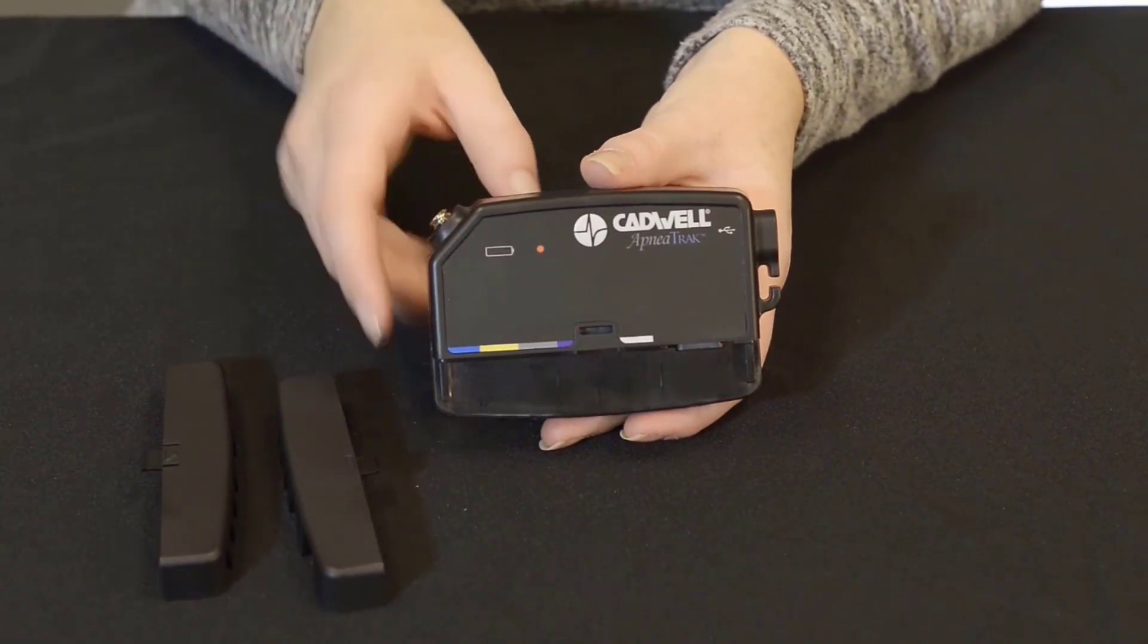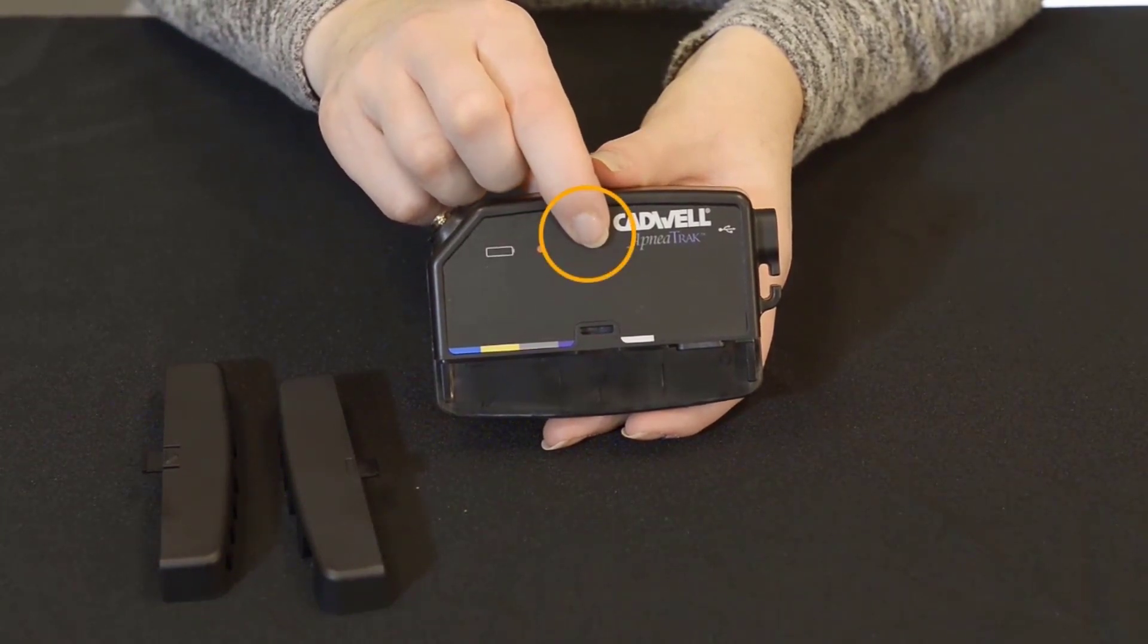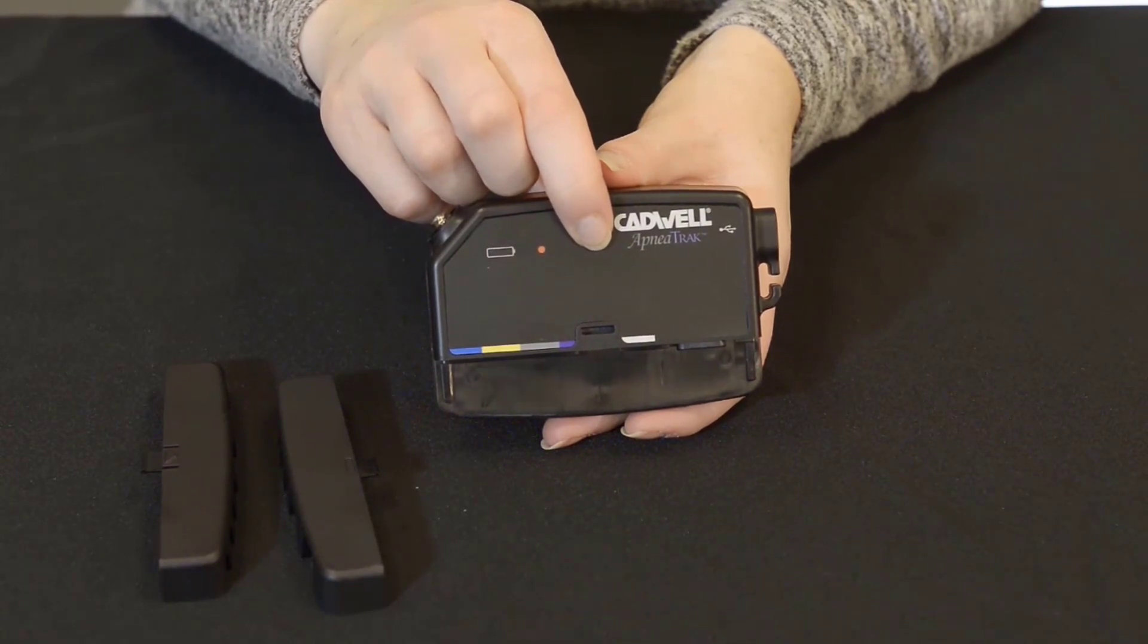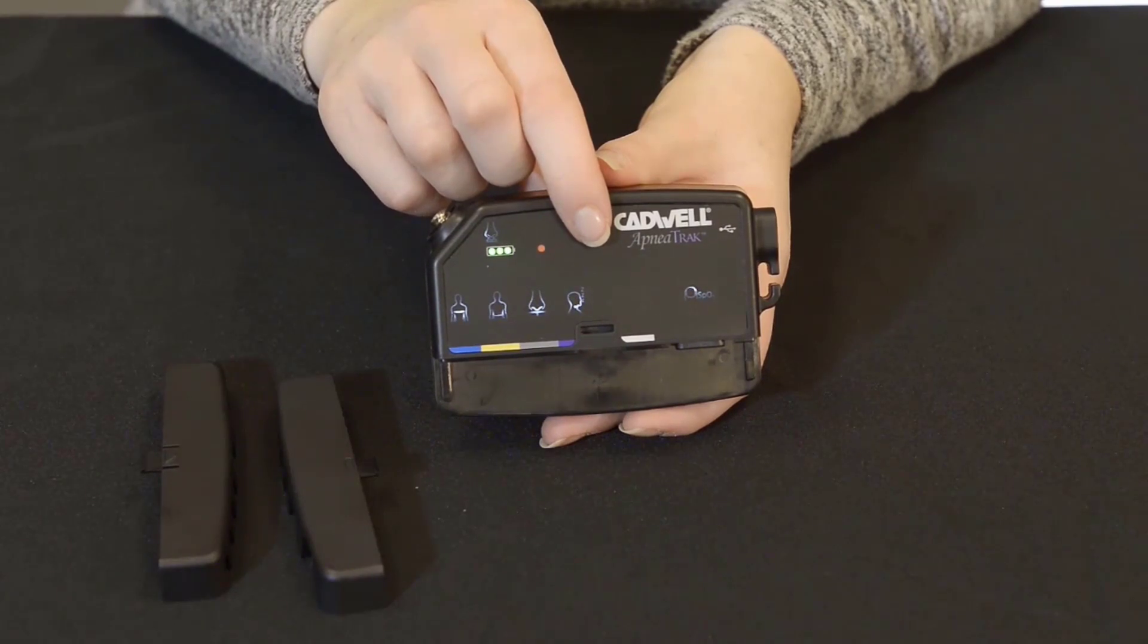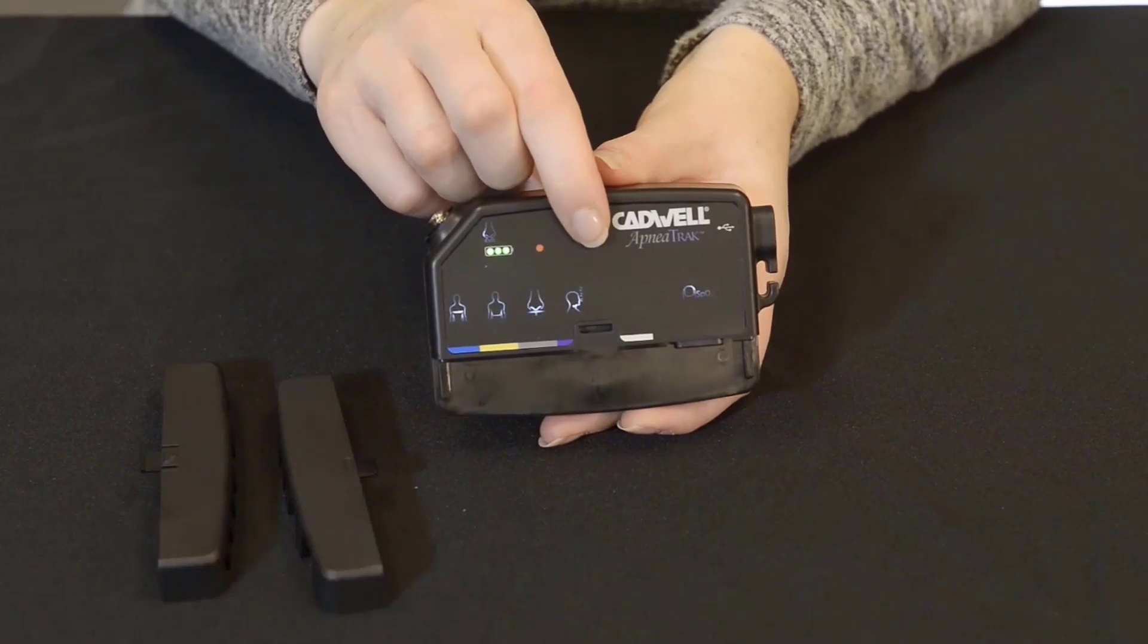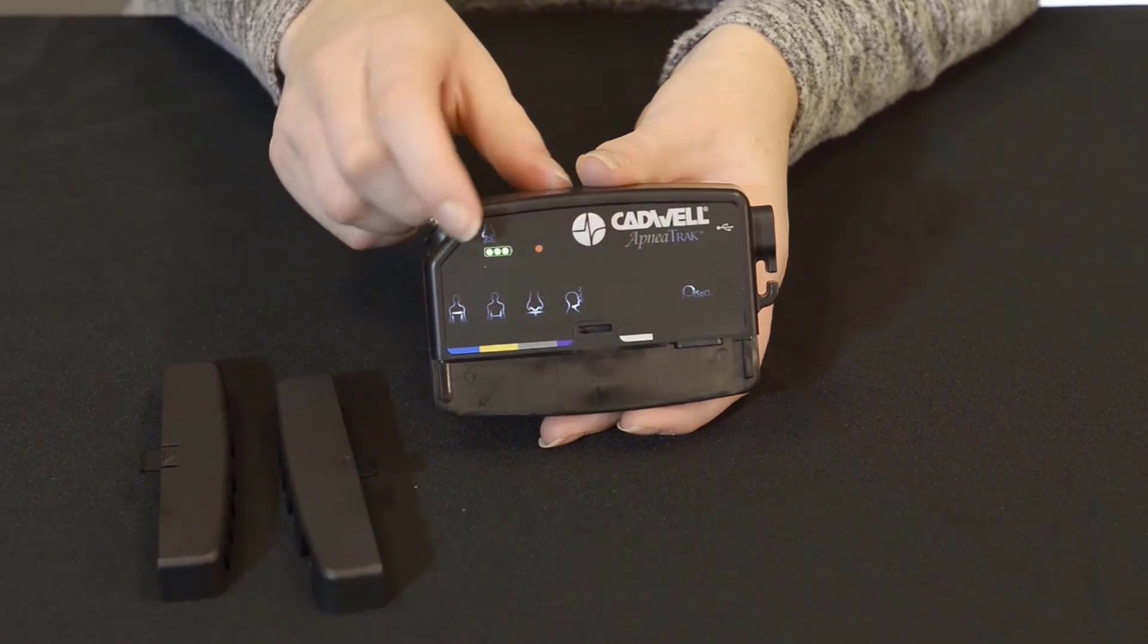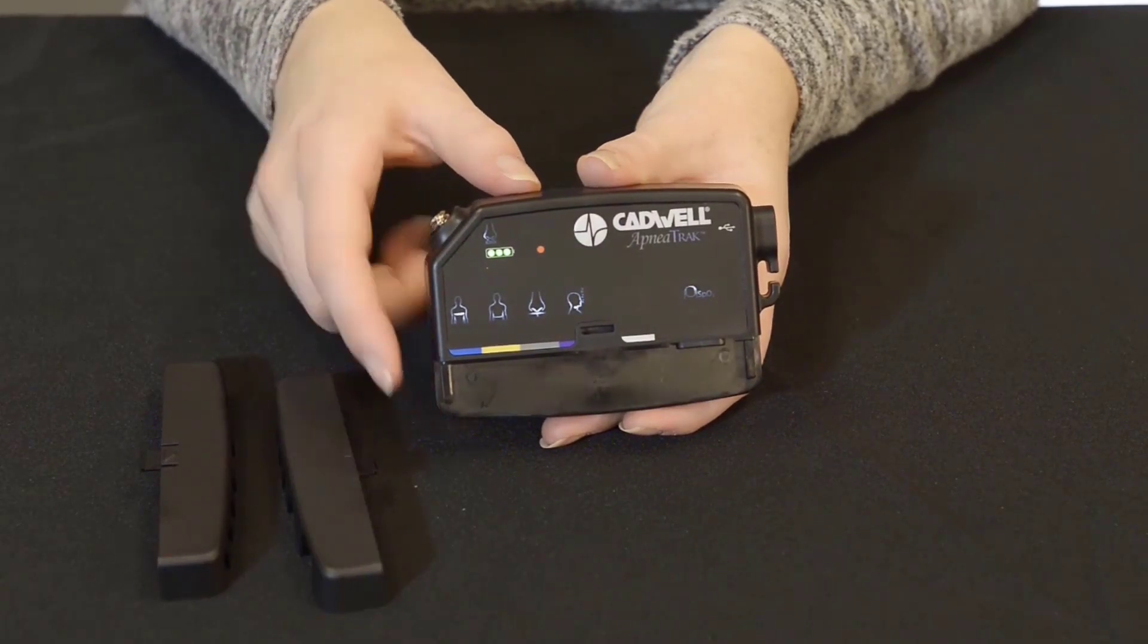On the top, centered on the device, is an event button. The button can be used to check the status of the device, start a recording, or place an event during the recording. Pressing the button at any time will cause all configured recording channels to illuminate for 10 seconds. Pressing the button again while illuminated will extend the light for another 10 seconds. You can also see the state of the device when the button is pressed.